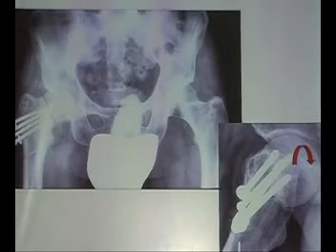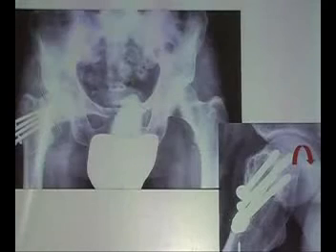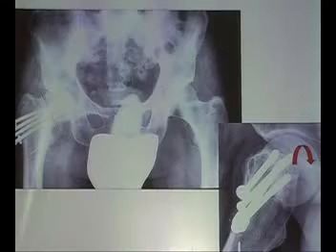This is a case recently done. Sorry. The fellow came with pain, and you see that is not reduction. The fracture line is still very steep. It's a Pauwels 3 line. The screws are not good enough, and especially the head is rotated. So you can wait months, it will never heal.